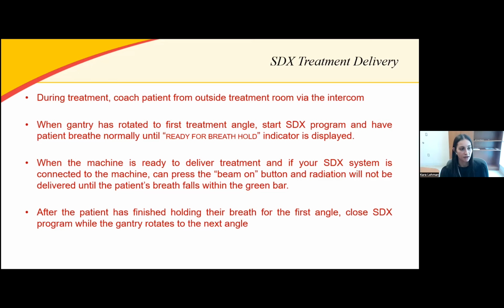And then after the patient's finished holding their breath for the first angle, I would just recommend, again, just like during imaging, just close the SDX program while the gantry rotates to the next angle to allow it to reset. And then you'll continue this process until all of your beam angles are delivered.